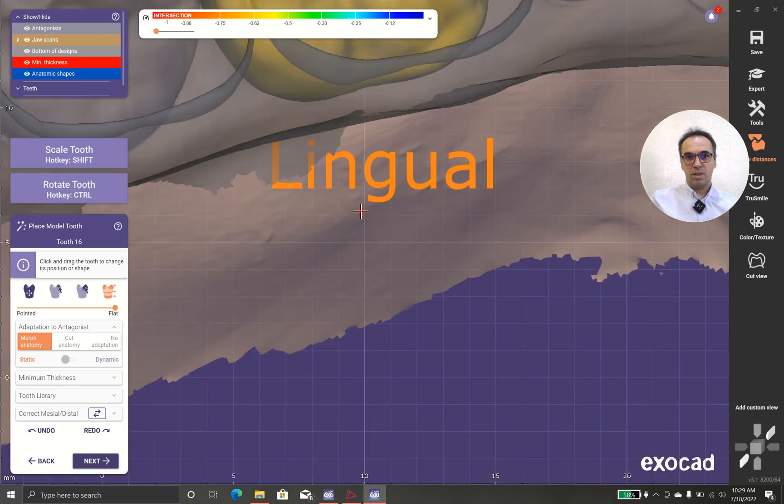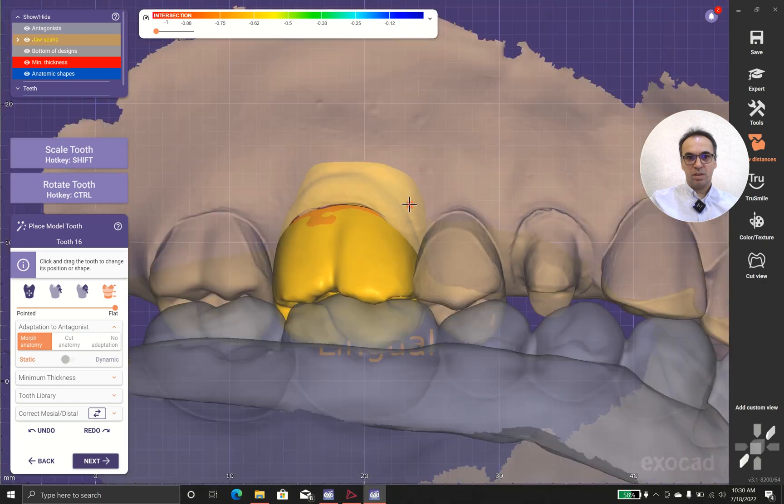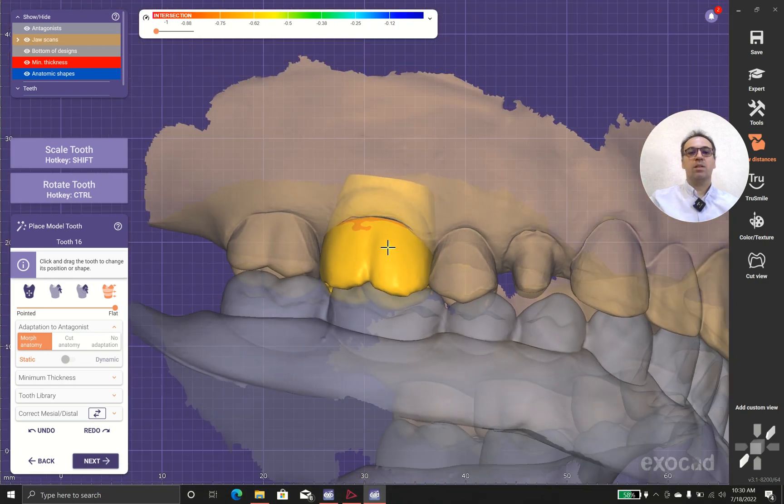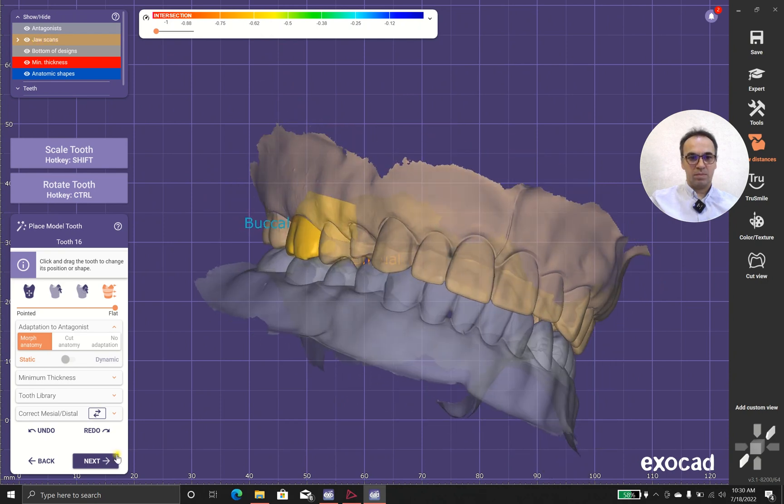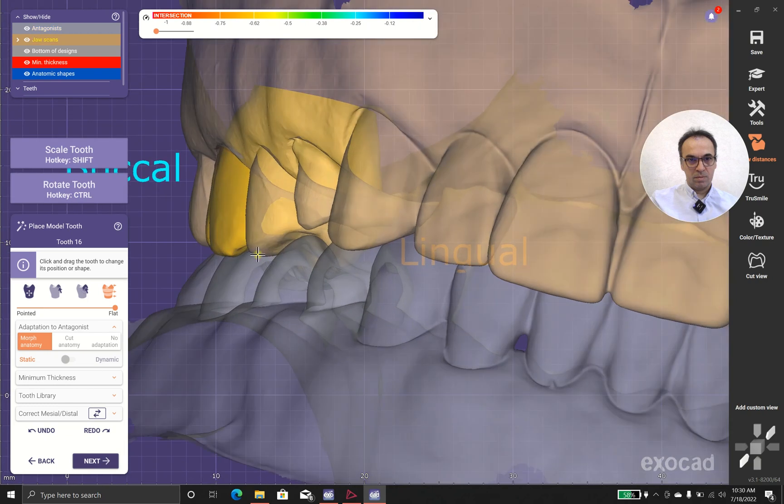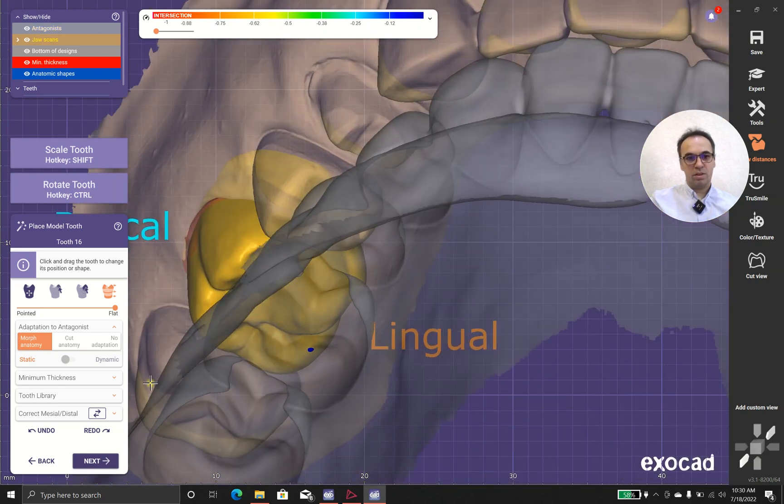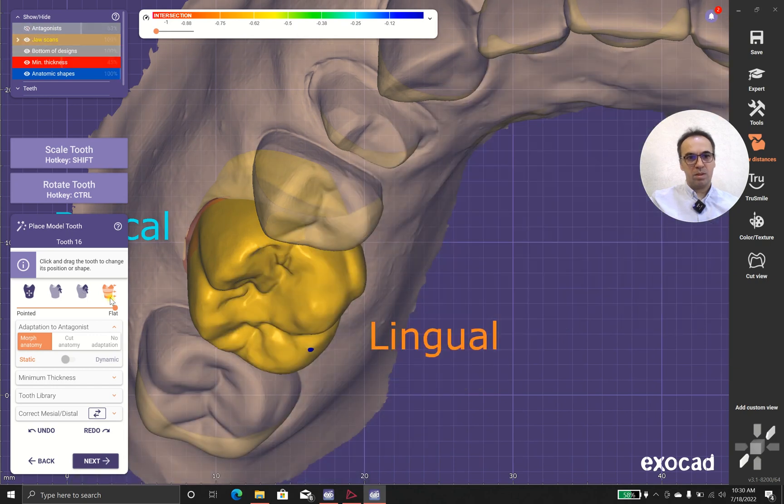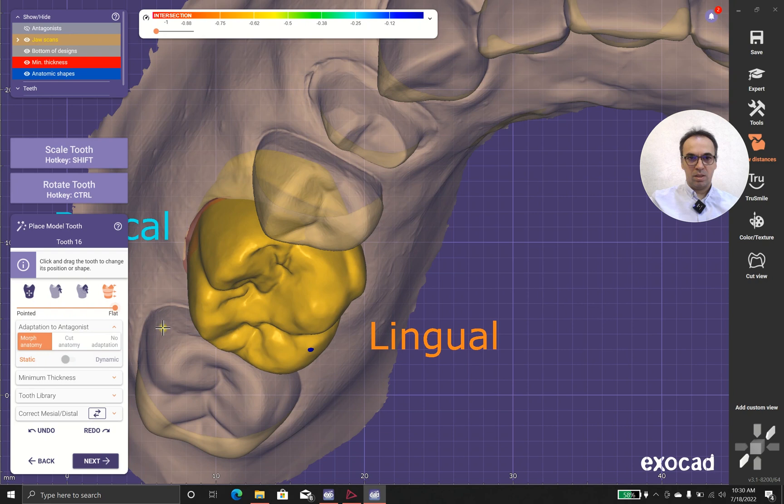And in case that you move it, it adapted with the teeth and opposing dentition. Okay, I'm happy with this thing and I think maybe this.